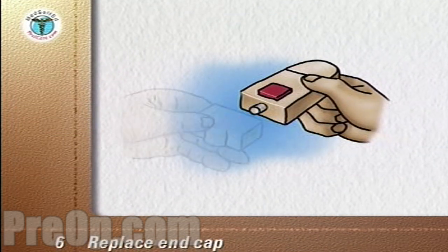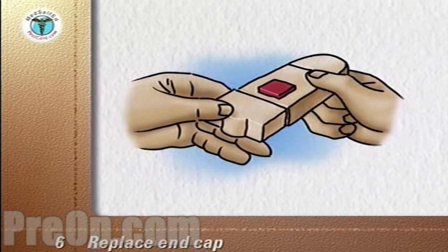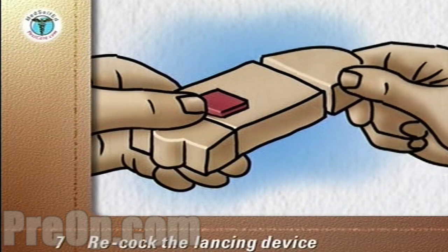Replace the end cap. The depth of the puncture depends on the end cap used. Re-cock the lancing device.